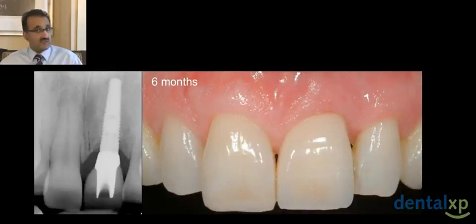Remember what the literature says, that we should see 1 millimetre to 1.5 millimetres of facial recession. But here we have this patient now, difficult case, not an easy case, thin biotype, large defect, prominent root architecture, and yet in 6 months we've now seen some coronal migration of tissue. You can see a little creep of tissue on the labial of the implant.